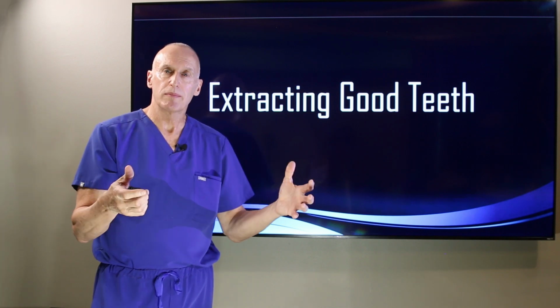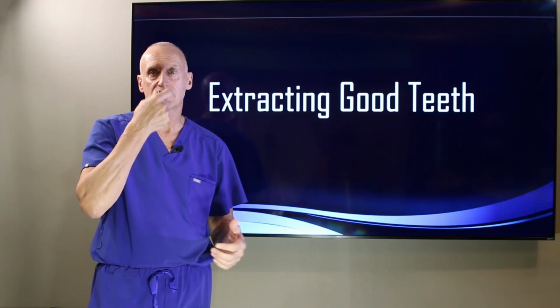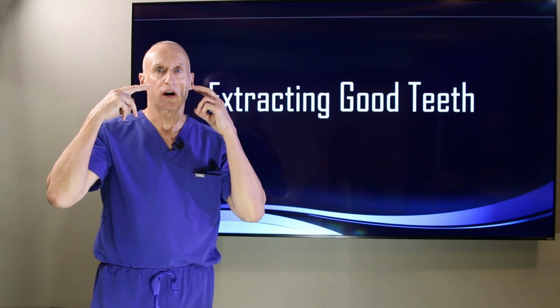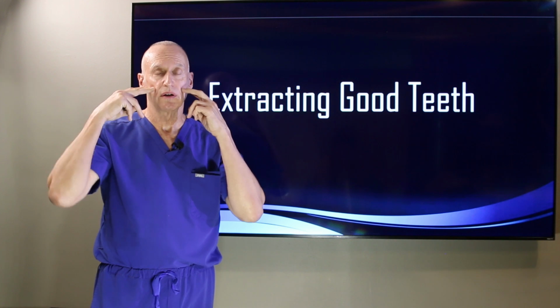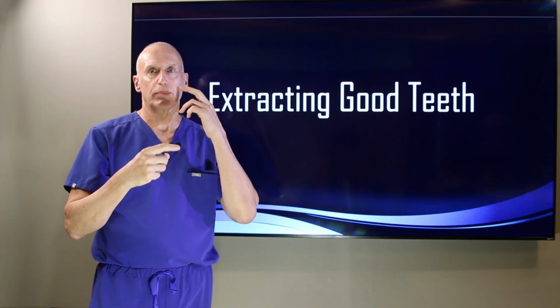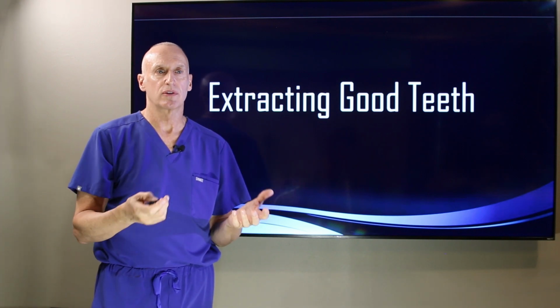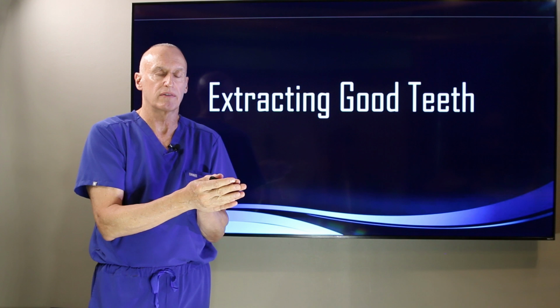And then come up with treatment plans to accommodate those good teeth. So maybe the 6 are the 6 front teeth. Then you talk about doing implants in the back only. If they're scattered around, if you've got a couple here, one here, and a couple there, then those teeth absolutely get in our way for implant treatment. So there's where the teeth are as one determining factor.